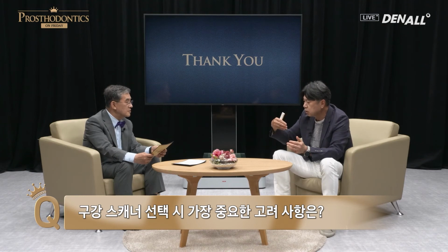But if you want to start like that, however, if you want to expand the usage in various areas, creating restorations, or use it for zirconia crown milling, we need to consider the software. What sort of software you want to use should be considered, and a scanner that matches well with such software can be selected. Most importantly, what you want to do with a scanner should be determined first before selecting a scanner. Thank you for your answer.